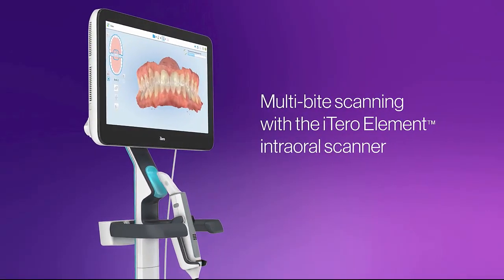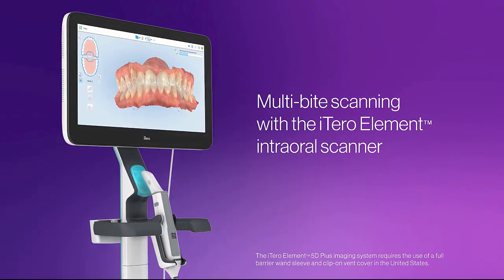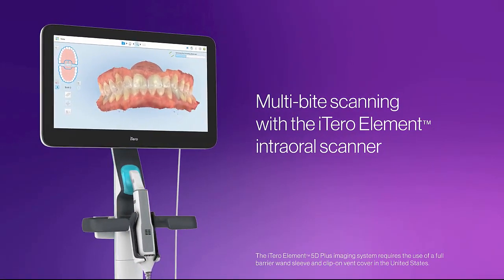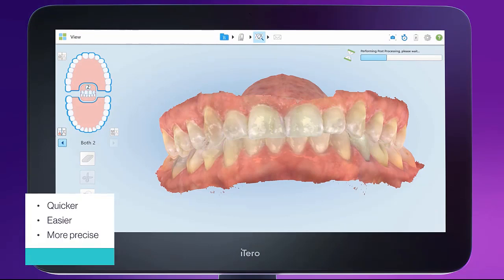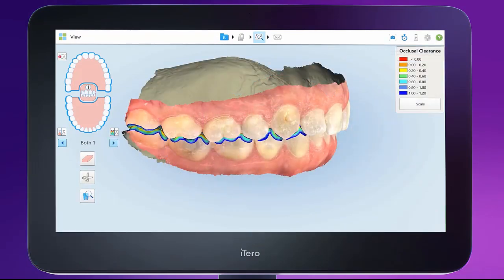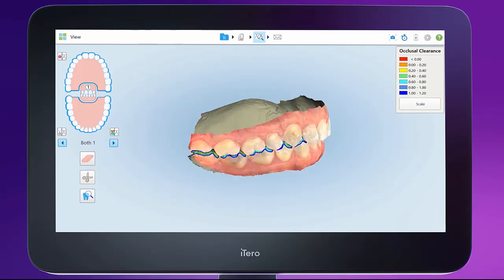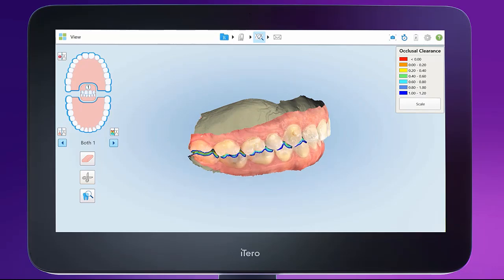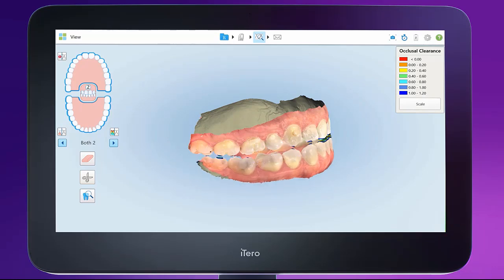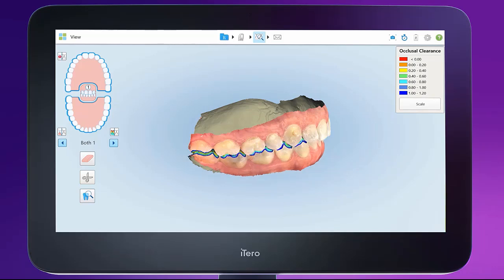Welcome to multi-bite scanning with the iTero Element intraoral scanner. The multi-bite feature makes it quicker, easier, and more precise when capturing and delivering bite information to the lab for appliance fabrication. This proprietary tool allows you to capture the bite in two positions, thereby enabling you to analyze and treat a patient who is using functional appliances.